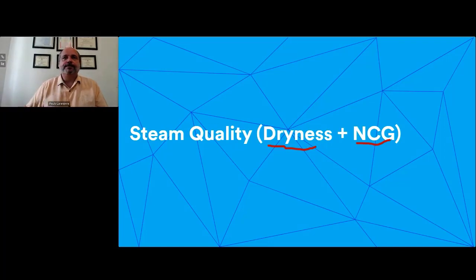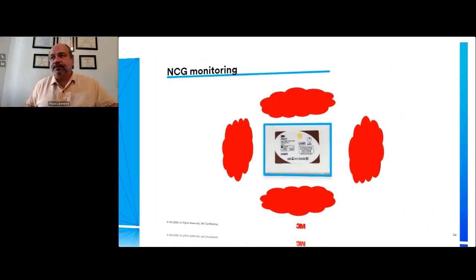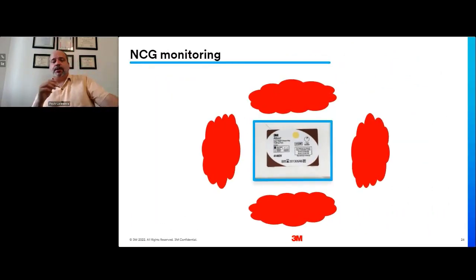How do we do that? So if you have a PCD inside of your chamber, that PCD will have on its exterior area a temperature colder than steam. So when steam goes into the chamber, let me change the color here.